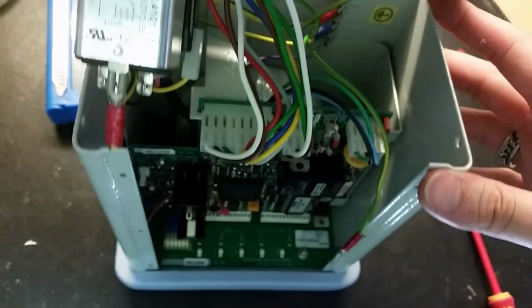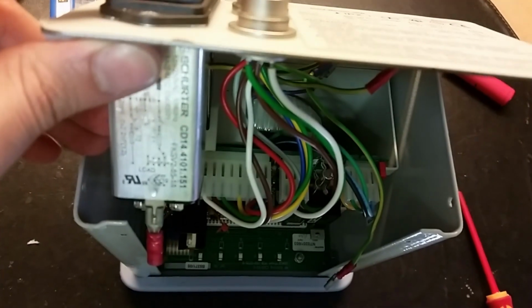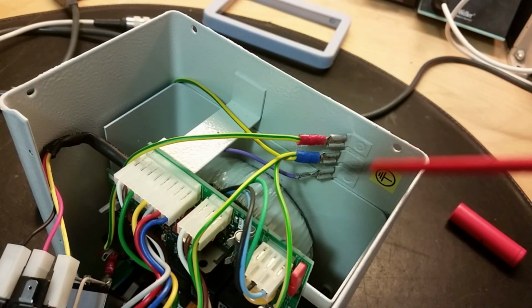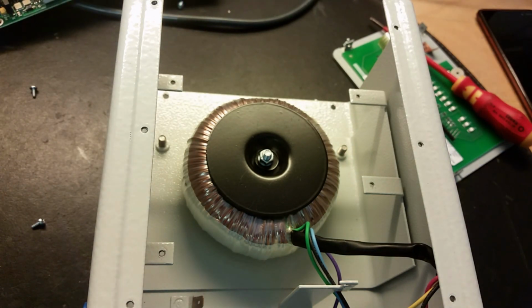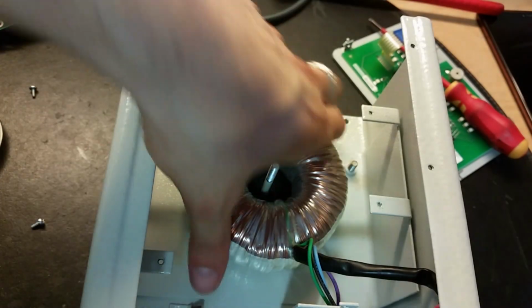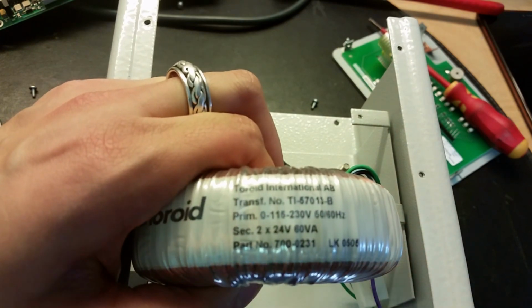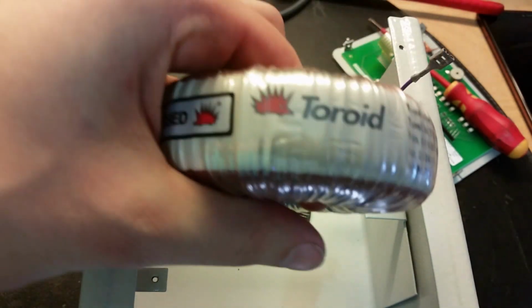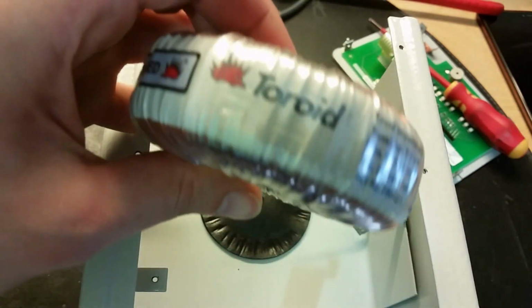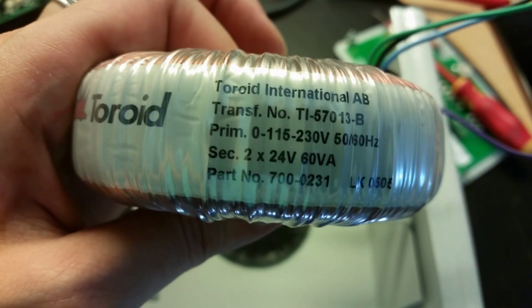So let's open it up like this. You can see the rather big selector switch and the interference filter here. And look at that beautiful earth terminals here. Very nice. And if you take away the circuit board here, there we've got the transformer. And this transformer is 115 to 230 volts in, 24 volts out. So it's a very nice transformer made by Toroid and passed the test. Nice. Sadly, it doesn't say what the colors are, so I have to figure that out myself.